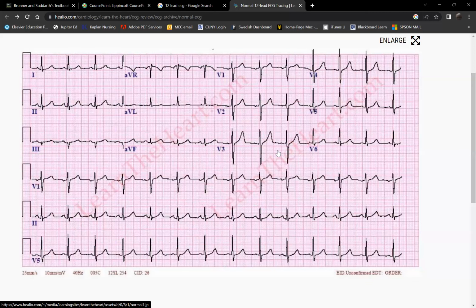No, it'll be different because let's say lead 1. Where is lead 1 taking the picture from? From my head. So therefore, lead 1 and lead 2, will they show you the same picture? No. So does that make sense? Now, why does the doctor order a 12 lead ECG? Well, this will help them identify where the problem is coming from, particularly which coronary artery is affected.